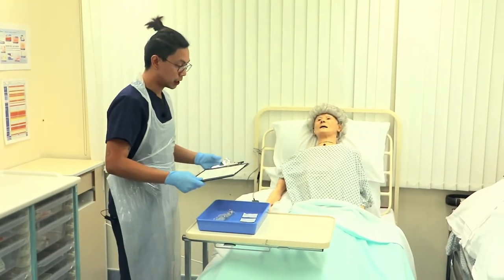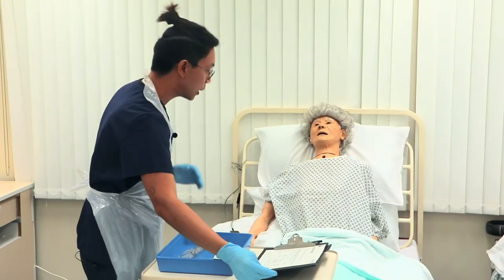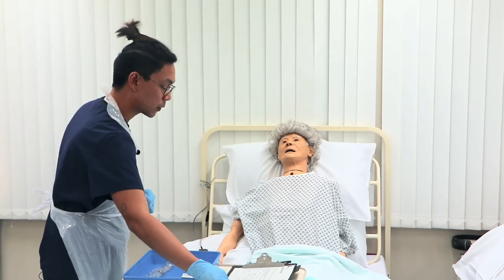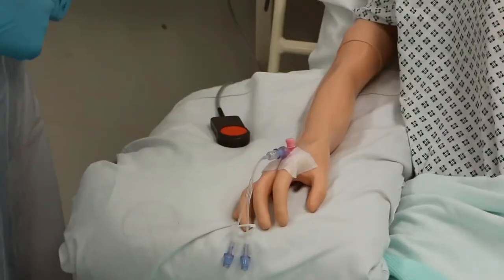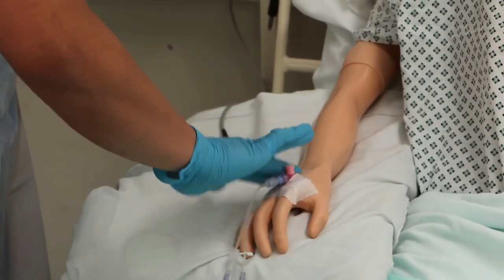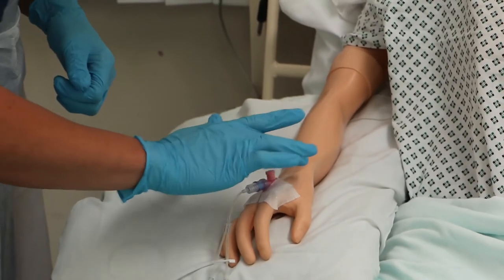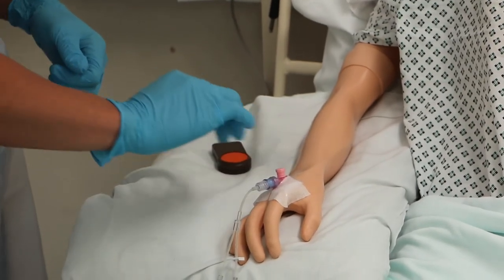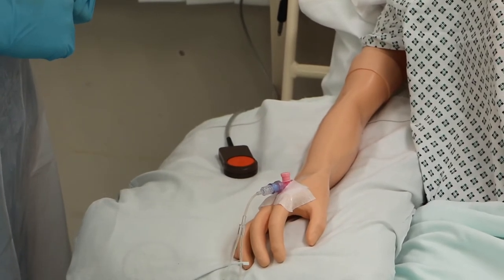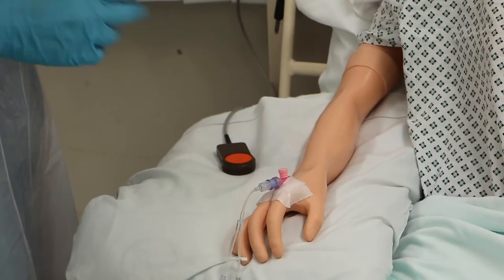Katherine, I'm back with the materials — are you still happy for us to proceed? — Yes, please. Before I continue, could you tell me your complete name and date of birth again? — Katherine Miles, 3rd of November 1989. I can confirm I still have the correct patient. Now I'm going to do an assessment on your cannula site. Do you feel any pain on this site? — No, I'm all right. I can see there's no redness, no swelling, and no palpable venous cord. The patient's temperature is within therapeutic range, so there's no pyrexia. The VIP score is zero, meaning I can continue observing the cannula site.